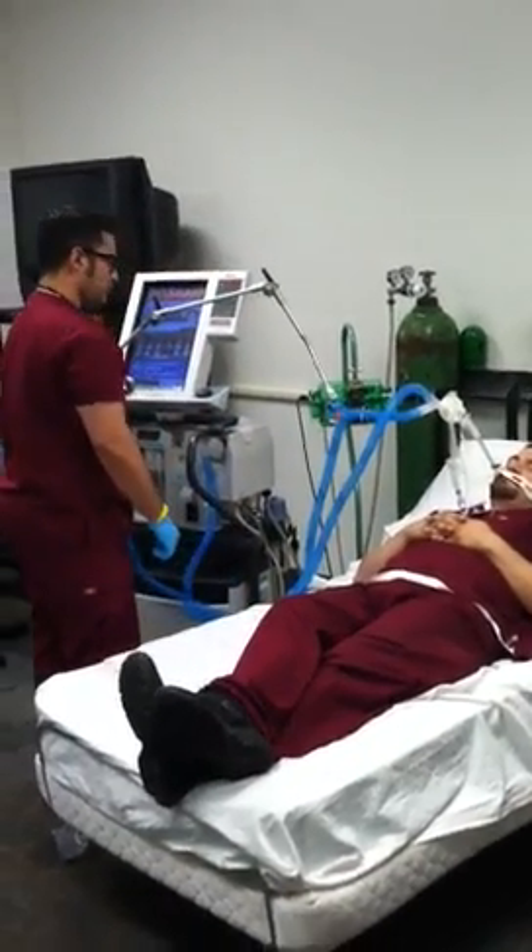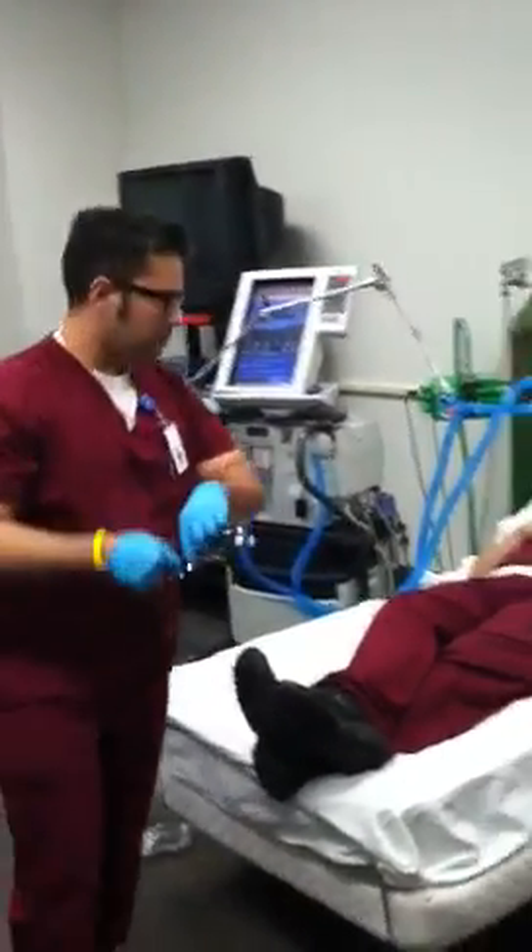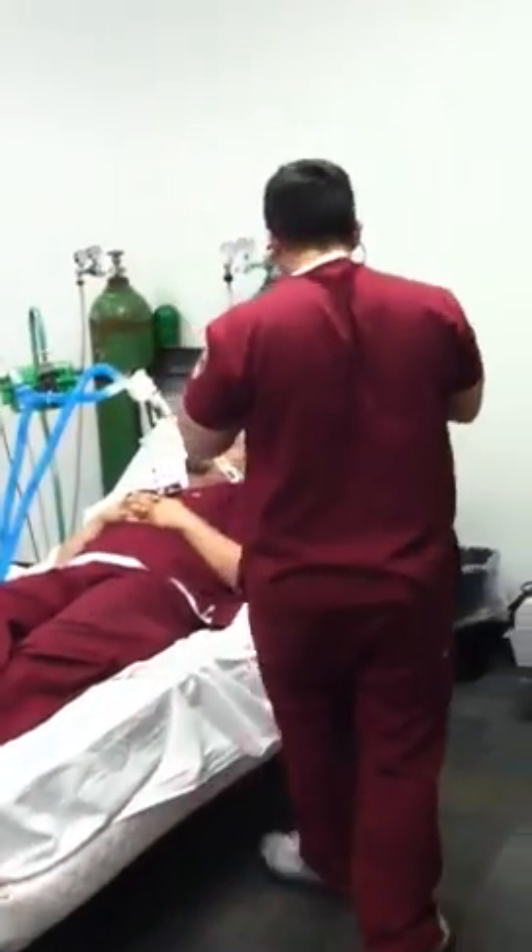He then reassesses the patient — auscultates the patient, notes heart rate, and patient appearance.